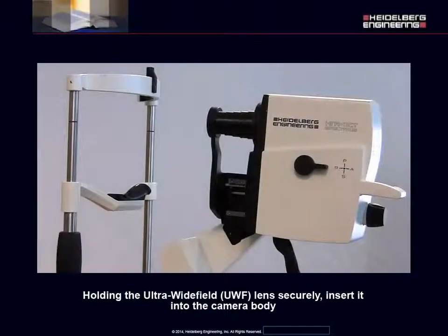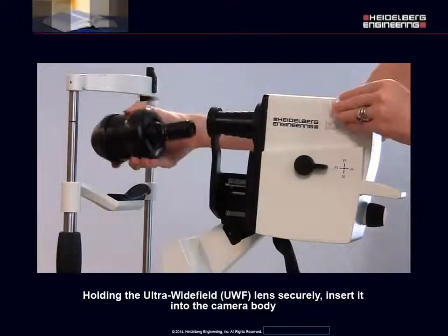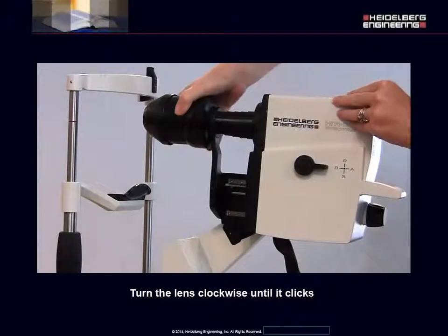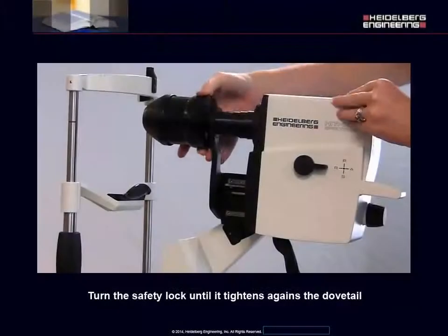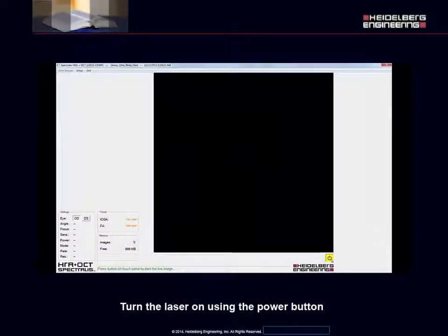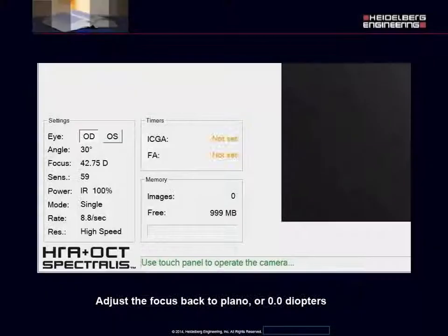Holding the Ultra Wide-Field lens securely, insert it into the camera body. Make sure the red dot is upwards at 12 o'clock. Turn the lens clockwise until it clicks. Turn the safety lock until it tightens against the dovetail. Turn the laser on using the power button. Adjust the focus back to plano or zero diopters.